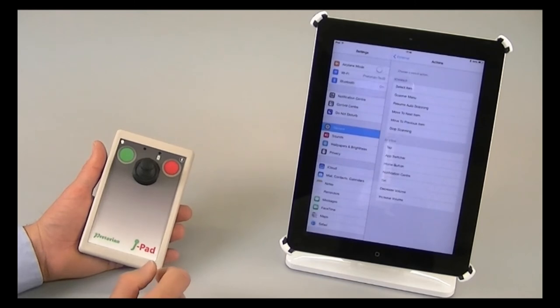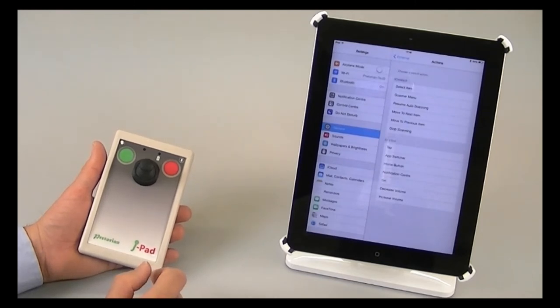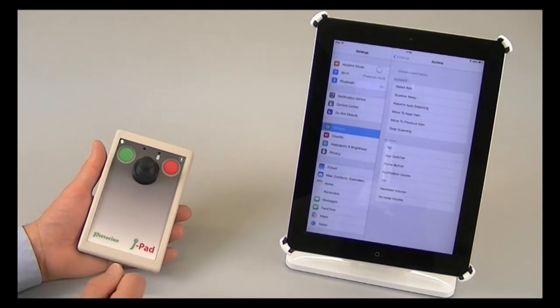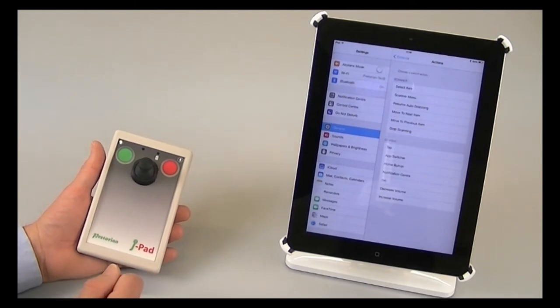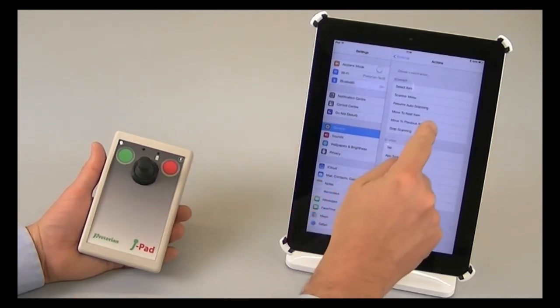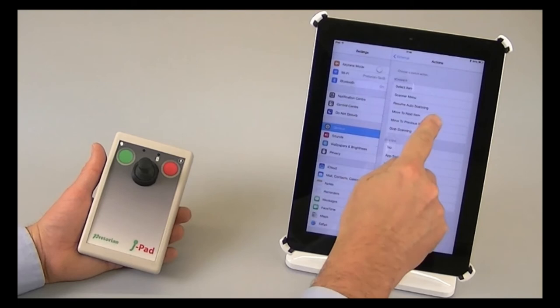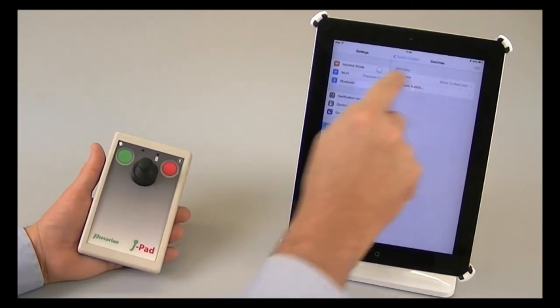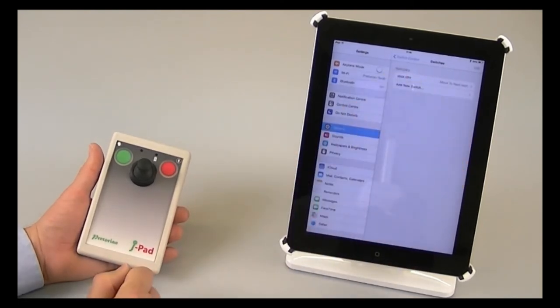Now I need to set a function for that movement. Now when I move the stick to the right, naturally I want to scan to the right. So in fact, I'm going to assign that to move to next item. And now you'll see it on the screen here.